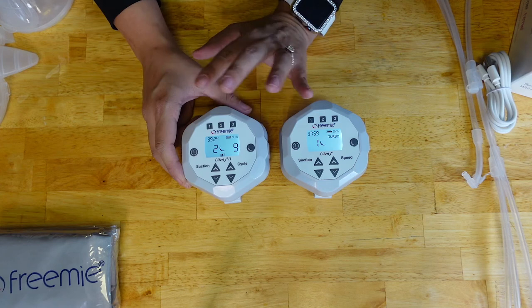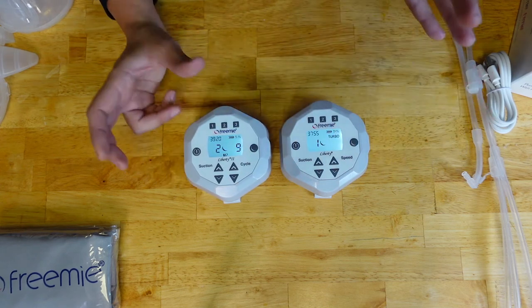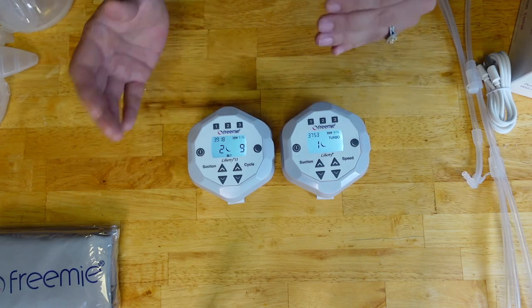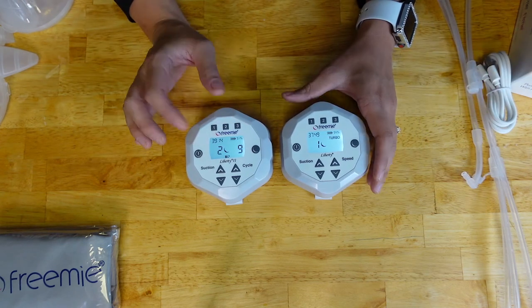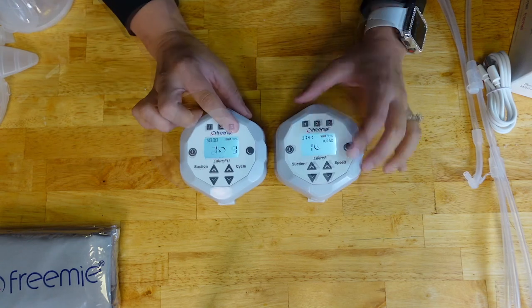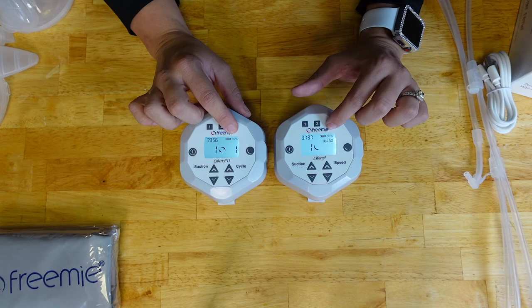If you're exclusively pumping, play around with the numbers and functions to see which one works best for you. But if you're breastfeeding and pumping, I recommend selecting settings that mimic your baby's latch. On the top it also shows the battery life by displaying the battery icon along with the percentage.